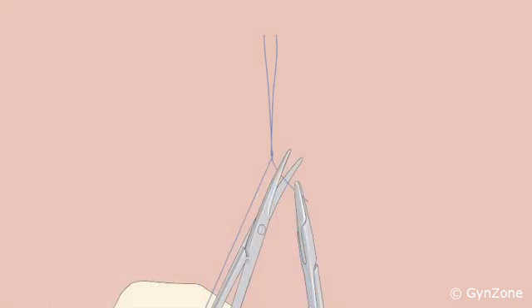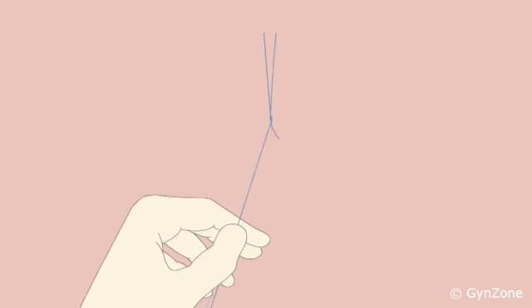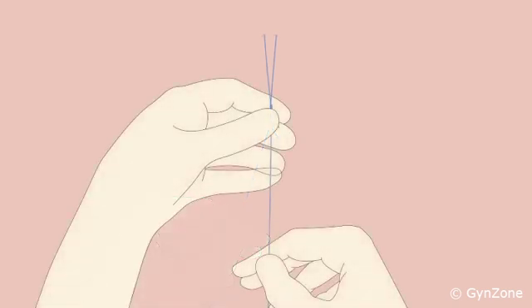Cut the short thread from the suture material approximately 1 cm from the knot. When you let go of the short thread end and pull on the long thread end, the knot will slide. If the knot does not slide easily, you can use your fingers to move it into place.